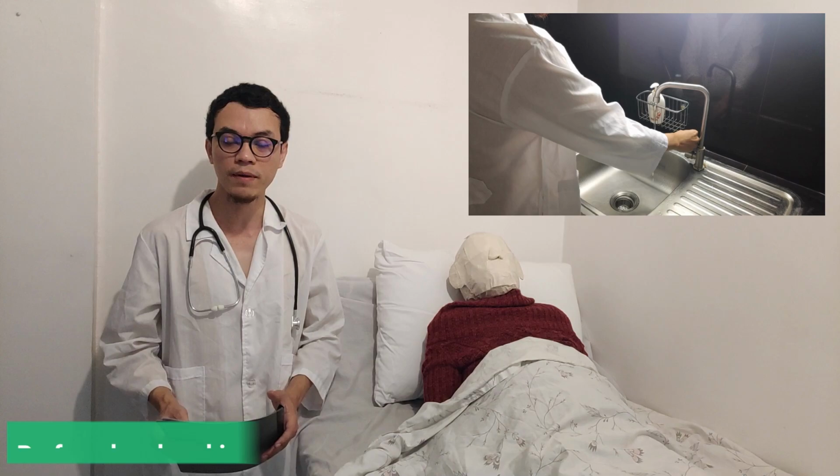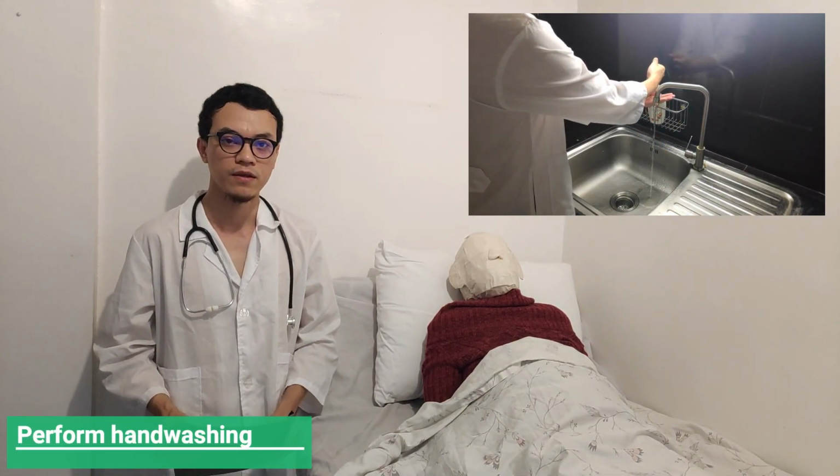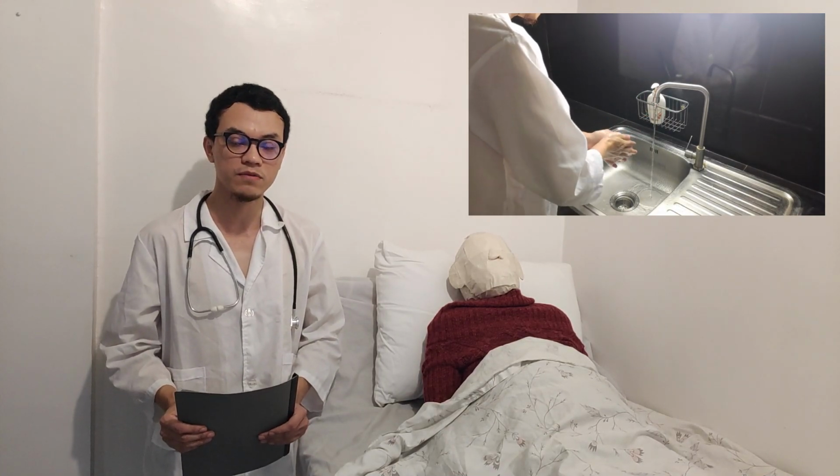Bringing all the materials needed will help us to perform our task efficiently and effectively because we don't have to go back and forth when we need something, which is time consuming. Next step is to perform hand washing and put on PPE if indicated. Hand washing deters transmission of microorganisms and bacteria.